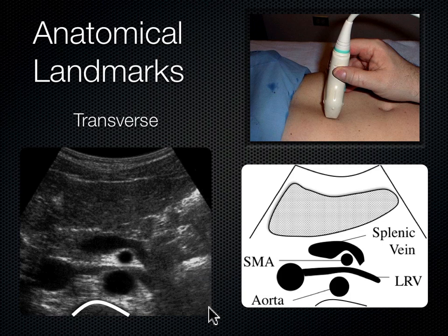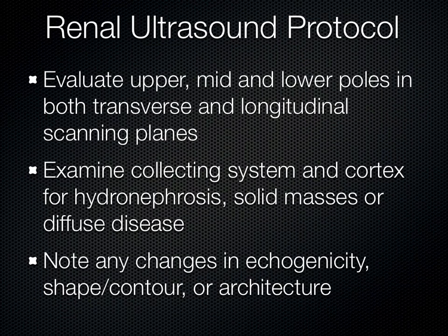So here's the left kidney, not seen on the screen. It's over on this side of the body somewhere. And its blood supply is sort of analogous to the right side of the body where we just were, where the right renal artery had to go behind the IVC to get to the right side. Well, on the left side, the left renal vein has to get over to the right side of the body to drain into the IVC. The way it does that is it gets nut-cracked between the aorta and SMA and gets into the IVC. Cool?